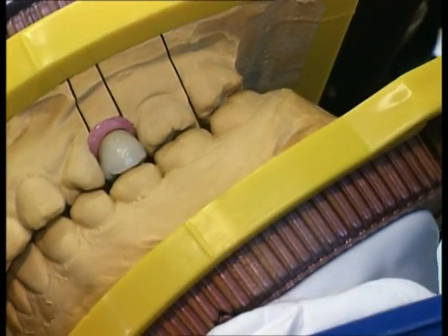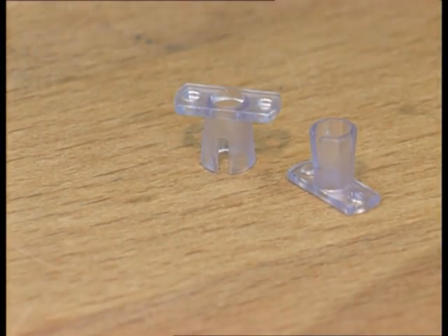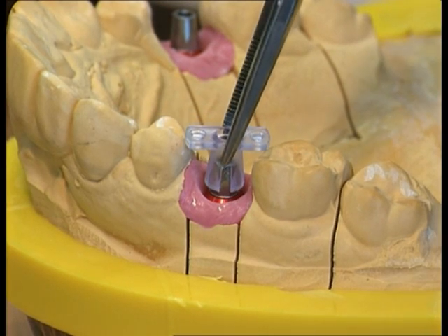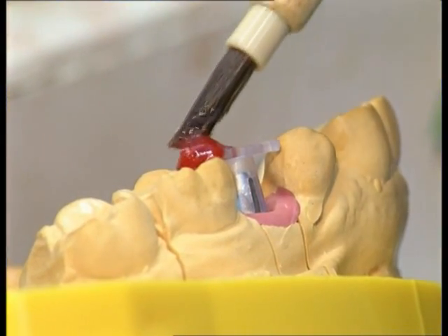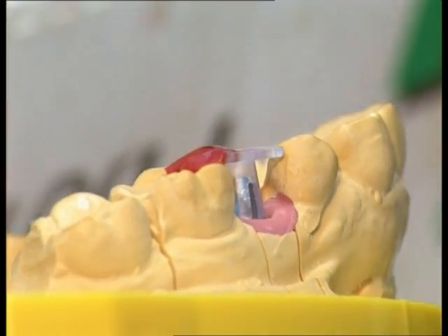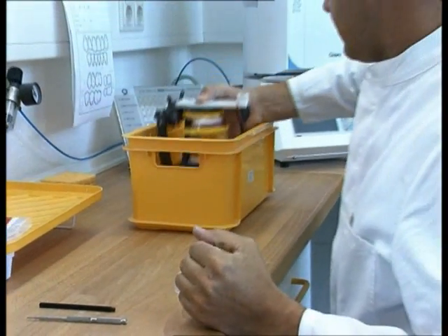To ensure correct transfer of the positions of the Synocta cemented abutment from the working cast to the patient in the dental office, a transfer aid can be used. It's made of plastic, can be attached by polymerization, and can be slid onto the Synocta cemented abutment. A resin index is created on the working cast in order to transfer the abutments to the patient. The structure is handed over to the dentist with the custom-reduced Synocta cemented abutments on the working model.